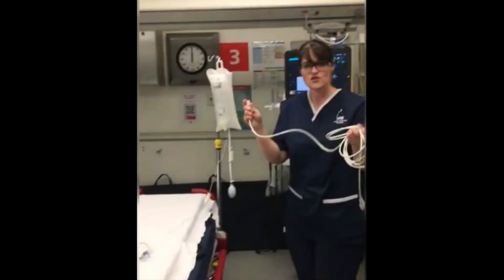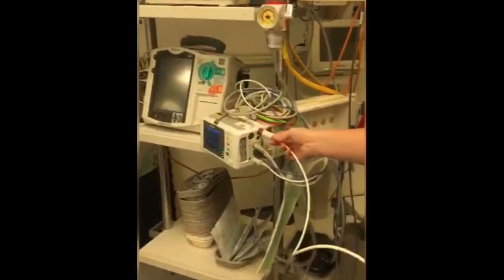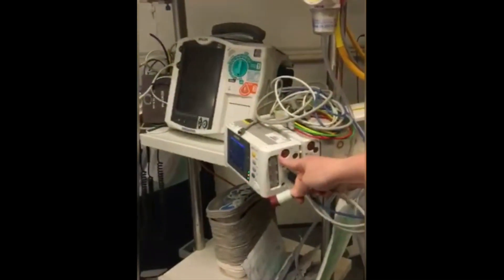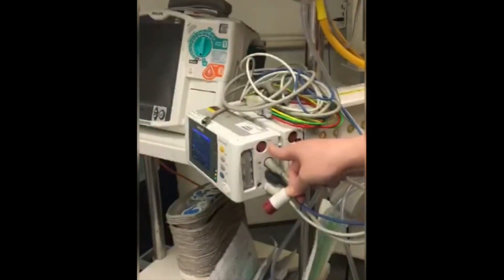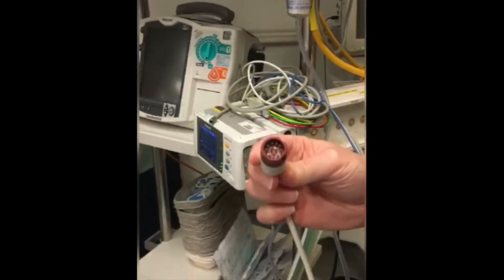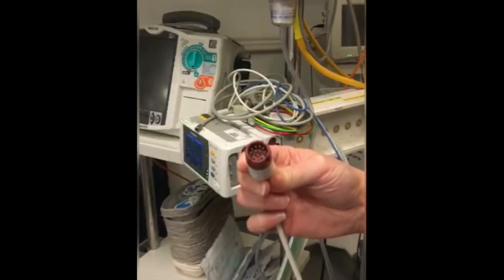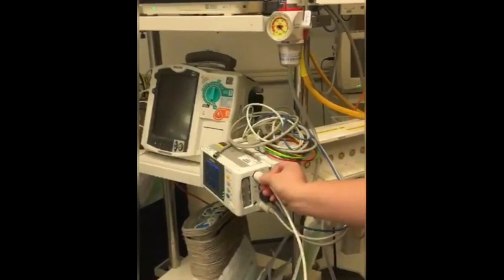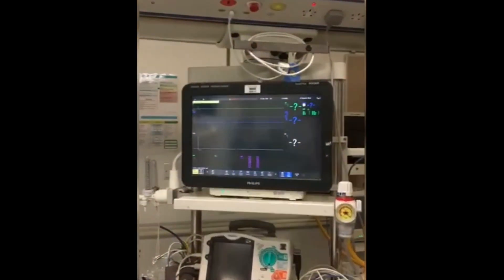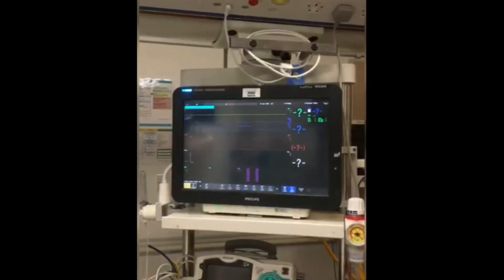What you'll need to do is put your transducer cable into the side of your monitor. Put the arrow in line with the black dot on the side. Make sure that the prongs are all in situ, with no bent bits, and that nobody has tried to force this into a monitor before. Pop it in the side and it should come up with a red line indicating that the cable is in place.